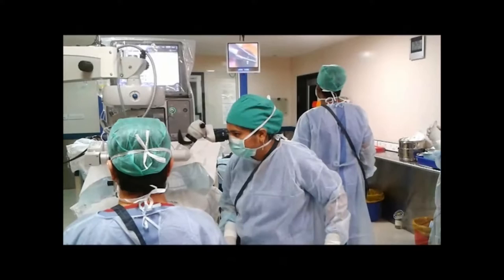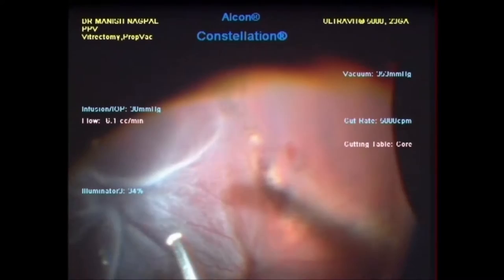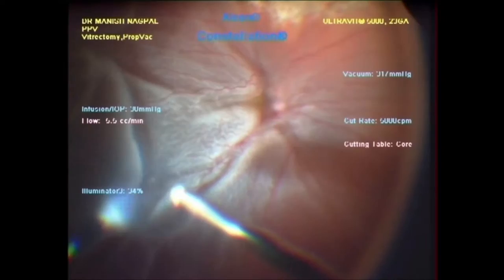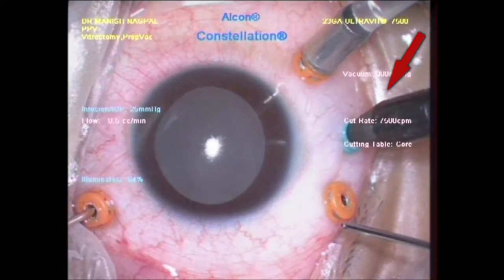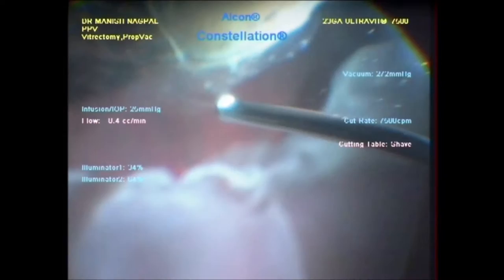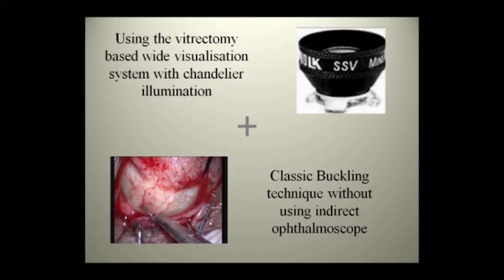Buckling surgery is on the decline over recent times, while vitrectomy is gaining popularity. This is because of extensive advances in instrumentation and wide field viewing systems. Using these wide field lenses, the overall view of the fundus during vitrectomy is excellent and much better than that of indirect ophthalmoscopy. Chandelier illumination has also revolutionized illumination, providing a bright, uniformly spread light for the wide field of view.